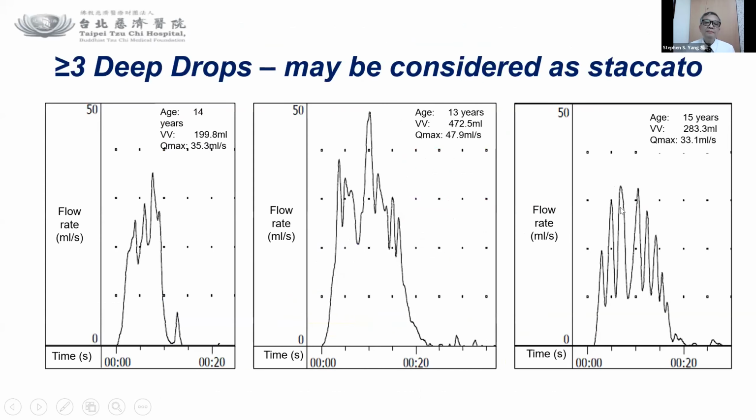Now, these are all typical staccato flow patterns because they have more than 3 deep drops.